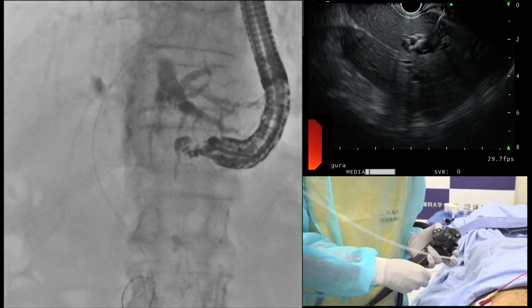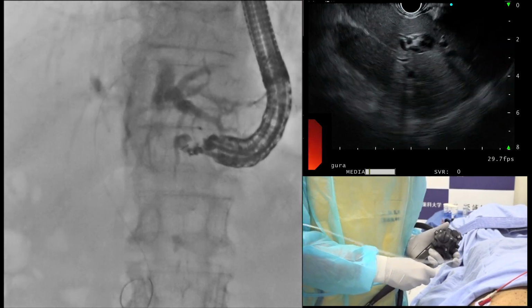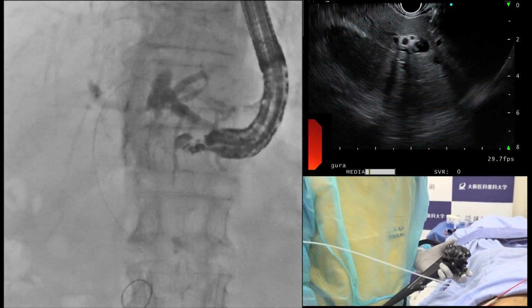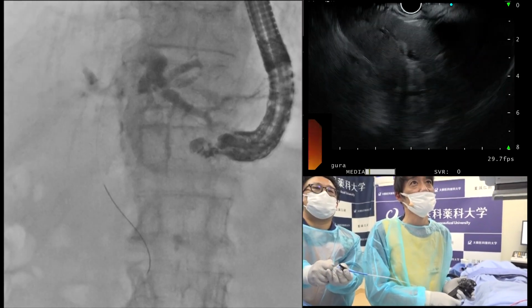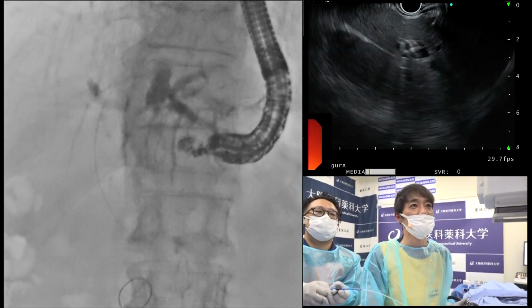What stents do you use for antegrade and which one for hepaticogastrostomy? I would like to recommend a laser-cut type stent to prevent stent misplacement.